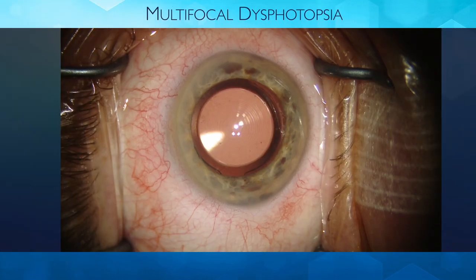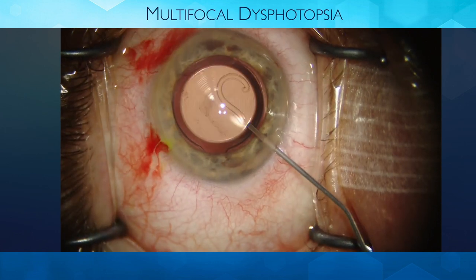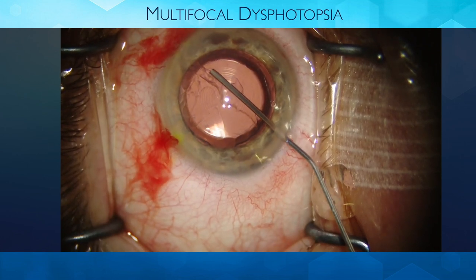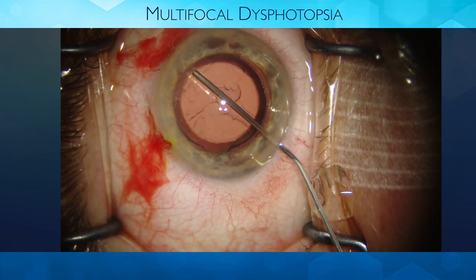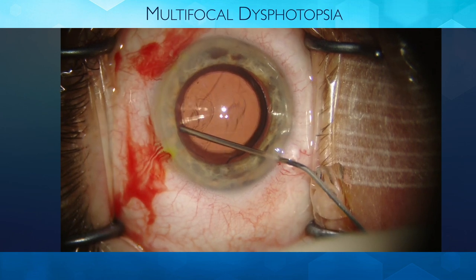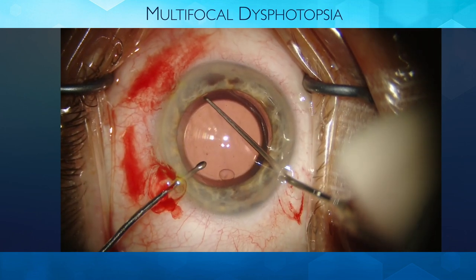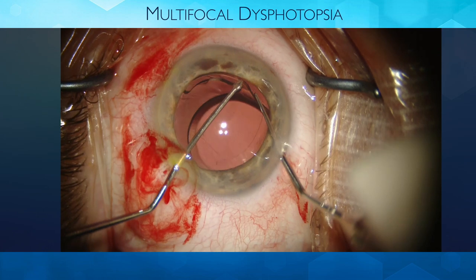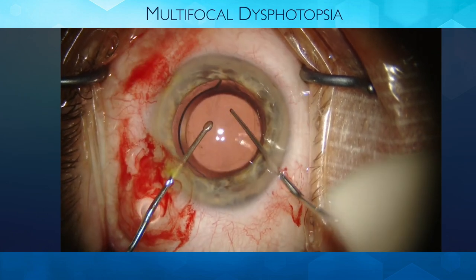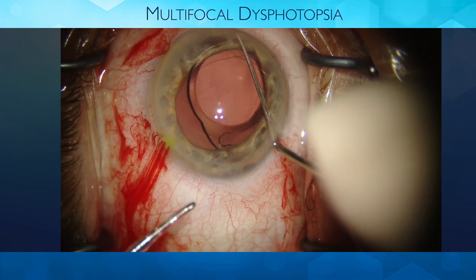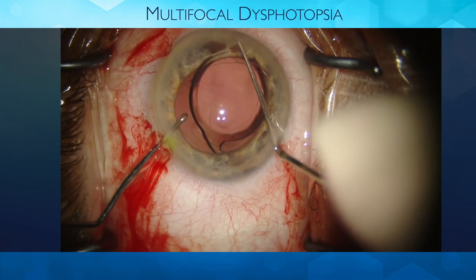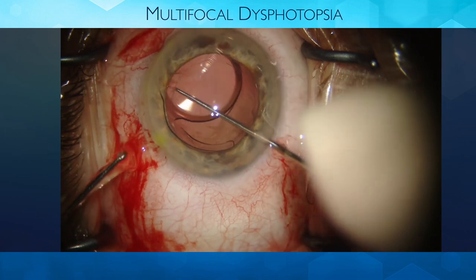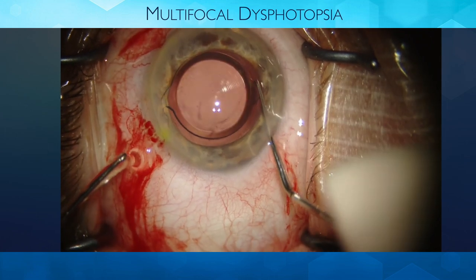Let's get into bag-to-bag exchange. One of the most common reasons we're exchanging IOLs is multifocal dysphotopsia. Even with the best intentions and the perfect candidate, some patients do not do well with glare and halos after surgery, and it's our obligation to help them. What you're seeing here is visco-dissection — you can use a cohesive or dispersive viscoelastic. Cohesive comes out a lot easier. Notice that we're not rotating initially; we're pulling it anteriorly and getting a sense for how fibrosed the haptics are within the capsule. Then we go after the other end using microsurgical forceps or a spatula, making sure to have viscoelastic above and below the IOL to protect the capsule.